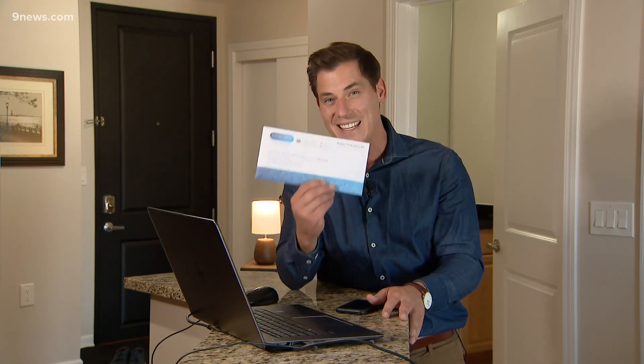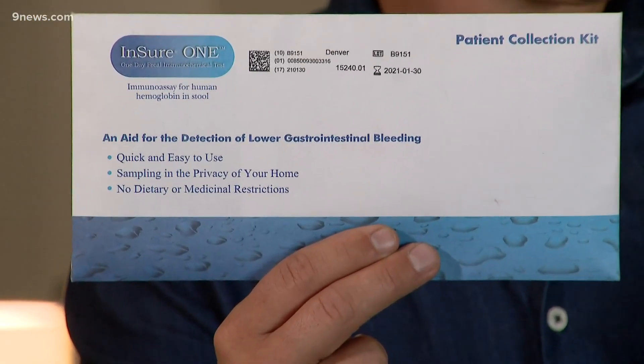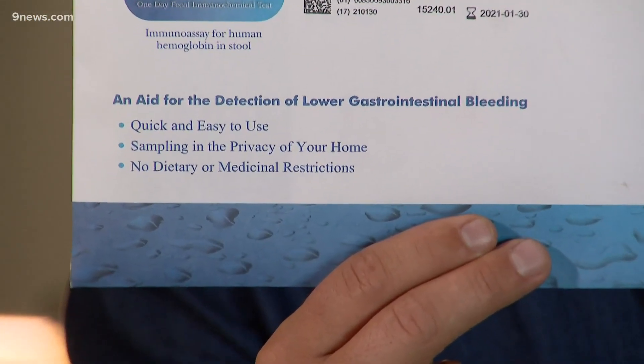Hey, what I'm talking about this morning is not a pile of crap. In fact, this envelope right here could be the difference between life and death. It's an at-home colon cancer screening kit.